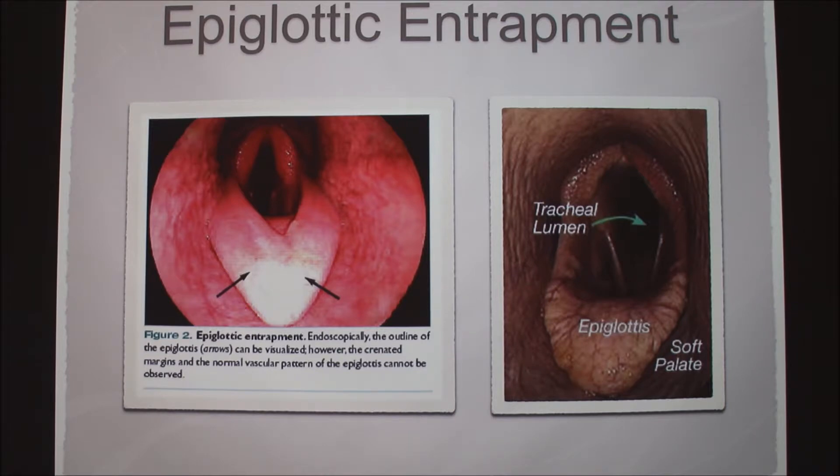The next thing is epiglottic entrapment. This is the normal picture on the right for reference. You can see there's a flap of skin under the epiglottis, and here it has actually flipped over on top of the epiglottis. It can cause respiratory noise, but it usually doesn't cause a decrease in performance because the airway is still open. However, if a person is trying to sell a horse and it sounds like it has a breathing problem, it can decrease the price.